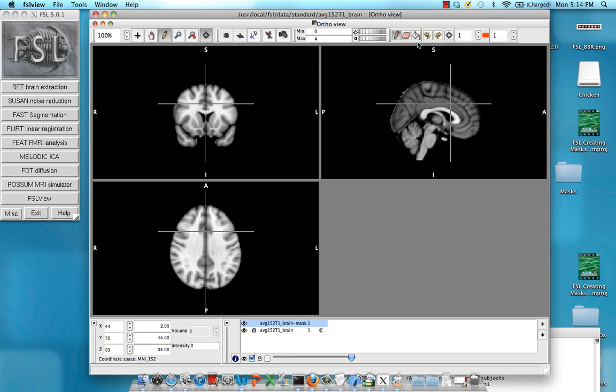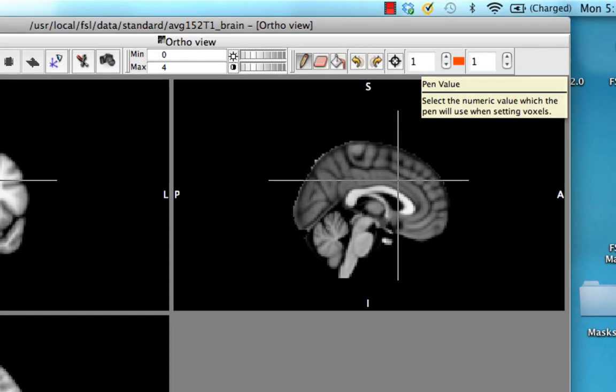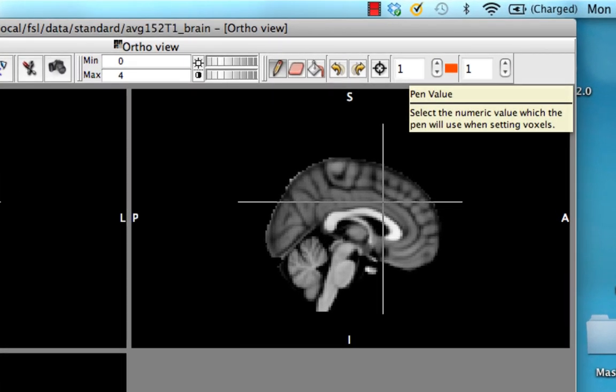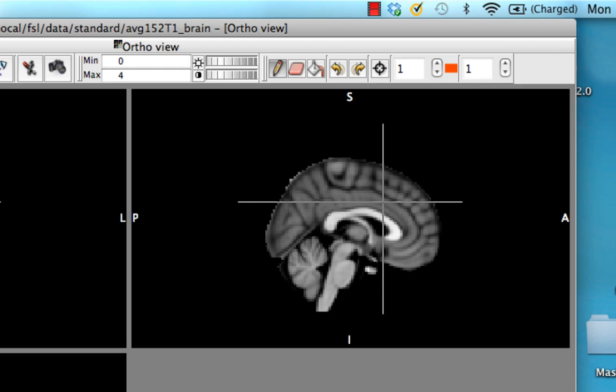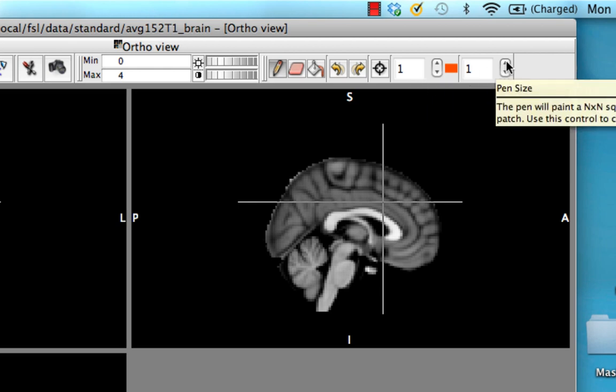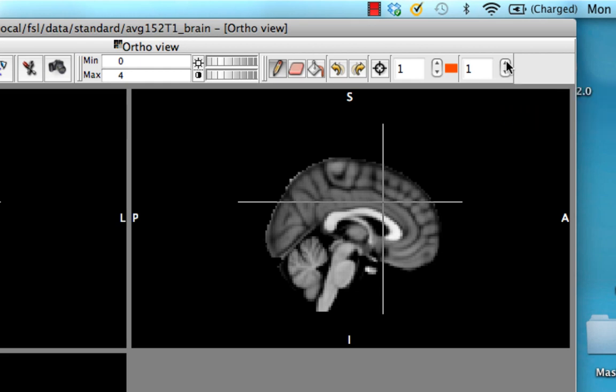Click on that and notice here you have, first of all, the pen value. We might have one color corresponding to one mask and another color corresponding to another mask if you want to draw multiple masks on the same brain. You can also increase the pen size. We can just increase the number until we have, say, five voxels at a time being created.